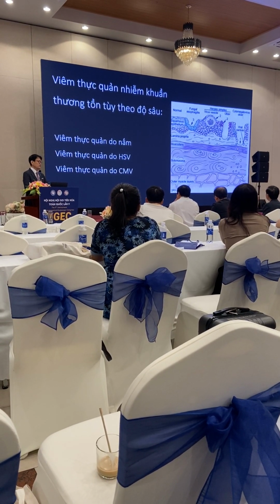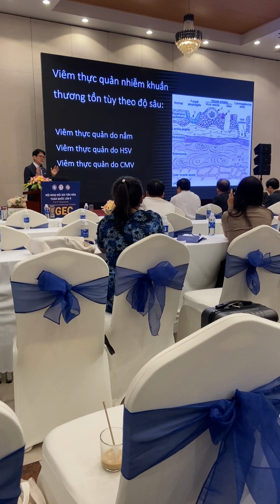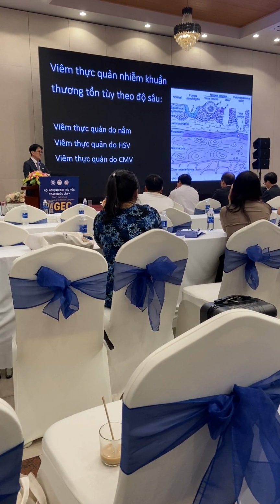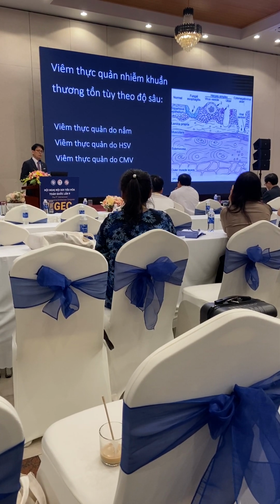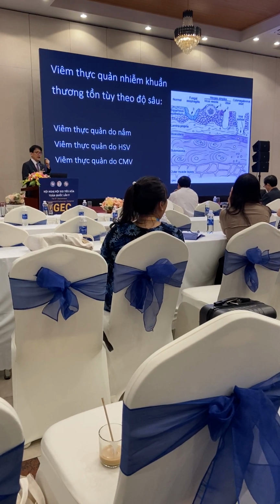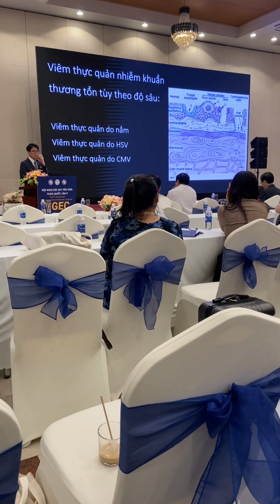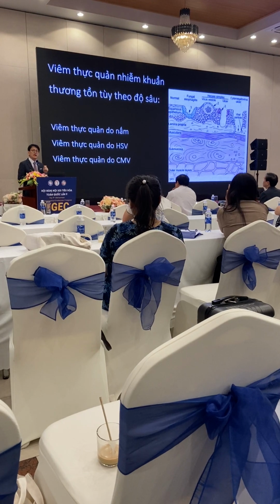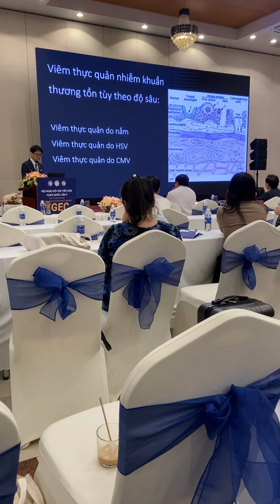By pathophysiology, Candida is only on the mucosa, so it's easy. I know that in some high volume hospitals you can see Candida esophagitis every day, but HSV and CMV are quite interesting. HSV is only mucosal. So like this, when you have HSV in your mouth or nostril, you can find the bullae or cyst over there, and it usually comes out. Same as the esophagus, because we eat and drink every day, it's easy to come out.